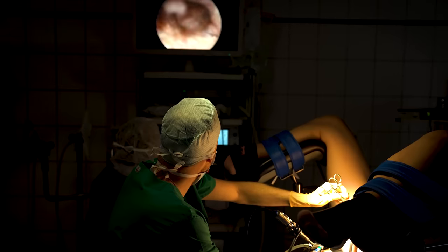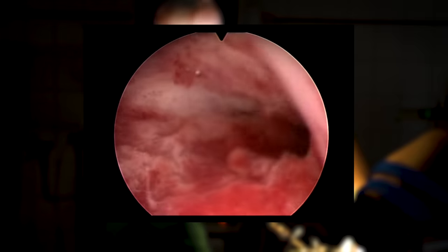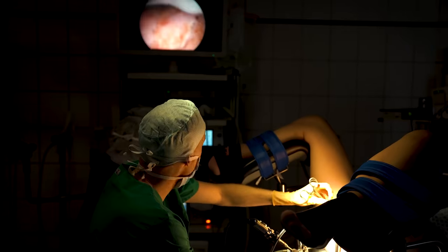If you're wondering what's happening in there — why there are air bubbles and it looks very turbulent — that's water. Water is inserted into the uterine cavity so that it stretches; otherwise it would collapse. Here we also see the opening of a fallopian tube, and those little strands hanging there are all mucus.